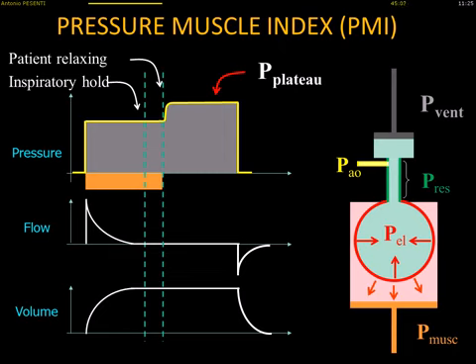If we close the airways at end inspiration, when the patient ends inspiration, if we occlude the airways at this point, the patient will start to expire.